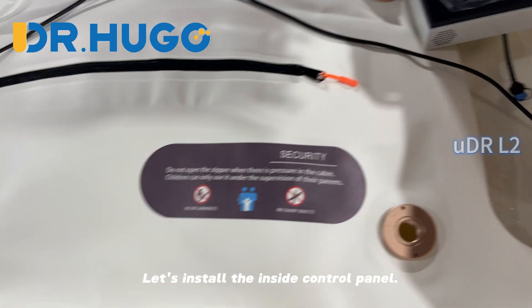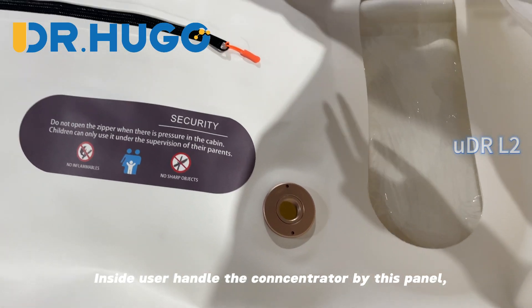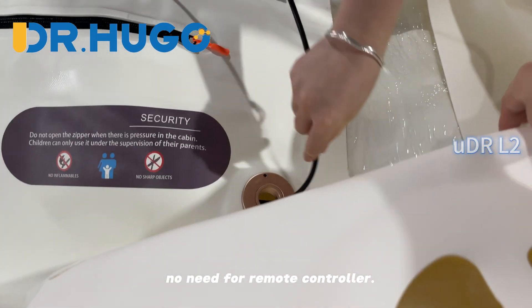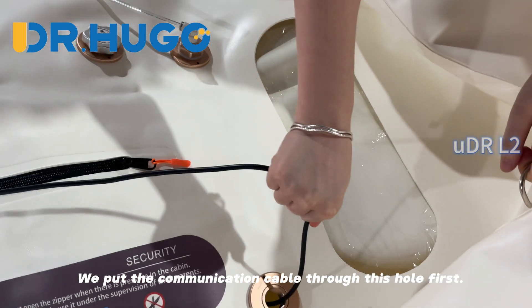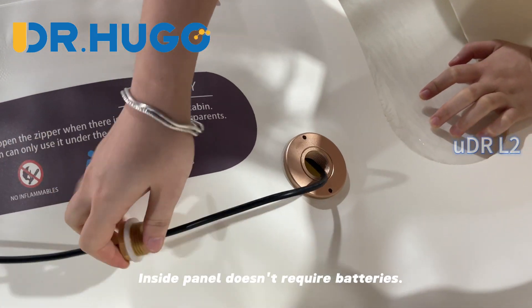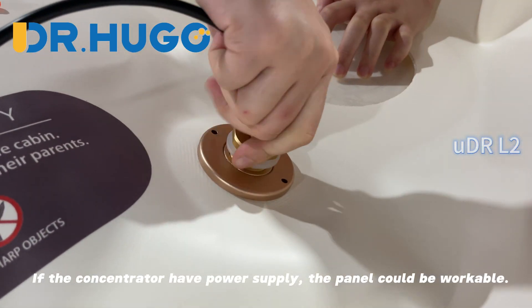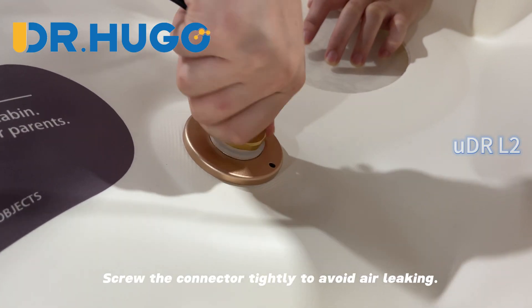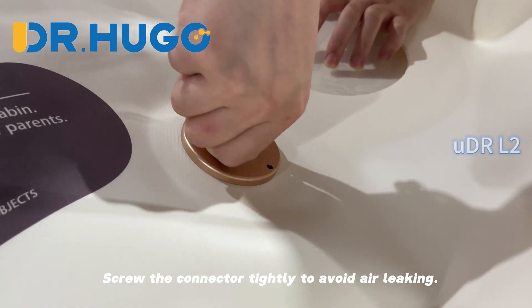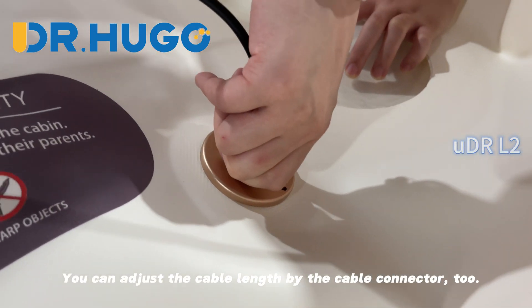Let's install the inside control panel. Inside users handle the concentrator using this panel — no remote controller is needed. We put the communication cable through this hole first. The inside panel doesn't require batteries; if the concentrator has power supply, the panel will be workable. Screw the connector tightly to avoid air leaking. You can also adjust the cable length using the cable connector.